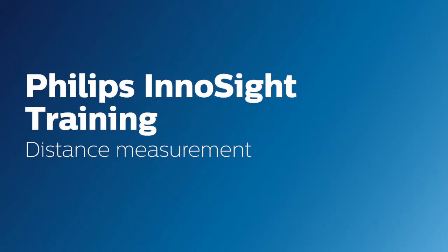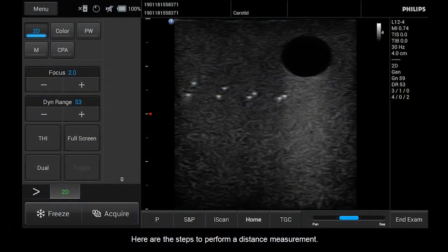Hello! Today we will take a look at how to perform a distance measurement on your InnoSight system. Here are the steps to perform a distance measurement.